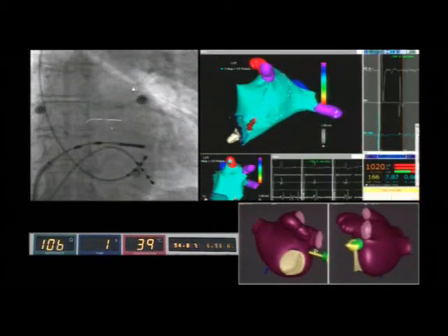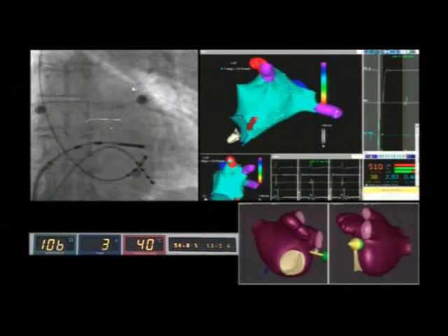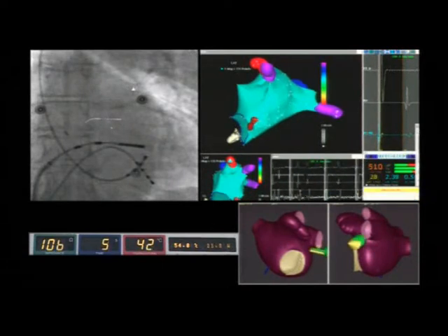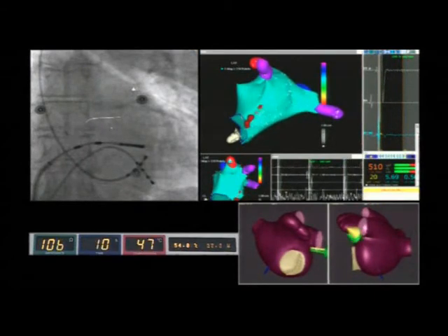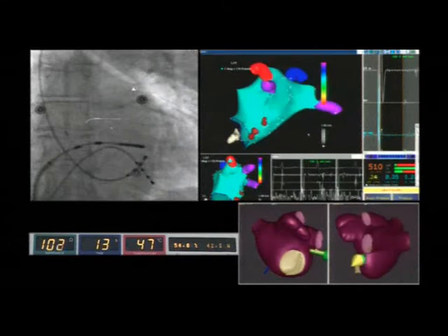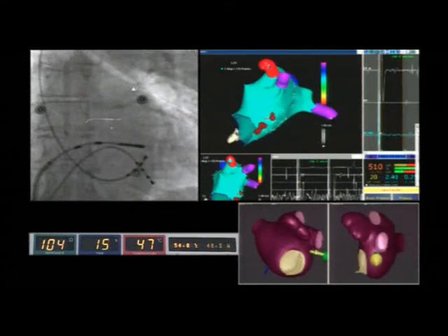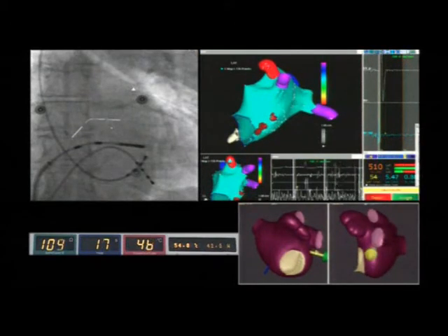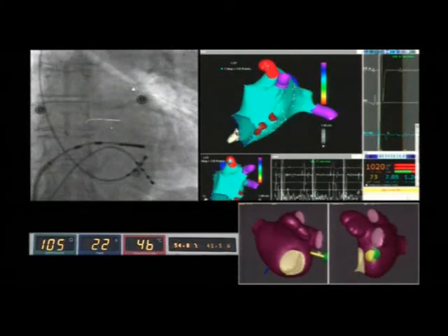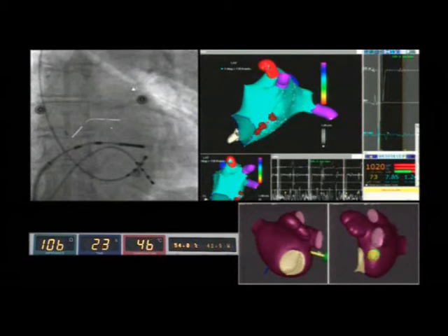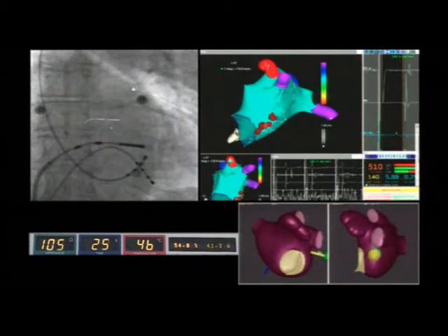The left inferior pulmonary veins are represented in violet. The radiofrequency applications are of short duration and are associated with a complete abatement of atrial electrograms. The lesions are linear and continuous, due to the catheter stability, as shown on the fluoroscopy image on the top left panel.